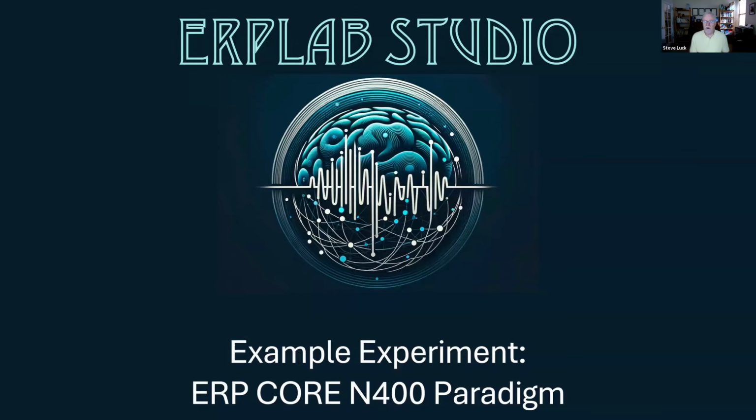This is the N400 paradigm from the ERP CORE. So the ERP CORE is a set of 6 common experimental paradigms where we have created optimized versions of them. Each paradigm takes only about 10 minutes to run. We have data from 40 neurotypical college students, so you can see what typical data should look like. And we have all of the analysis scripts in EEGLAB and ERPLAB, so you can see how we analyze our data. So I encourage you to look this up and use it. It's got all kinds of uses. People have published papers using our data. The more, the merrier.